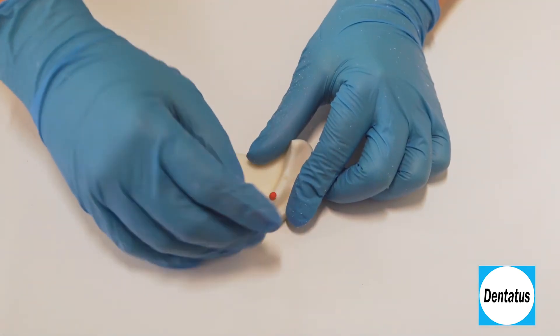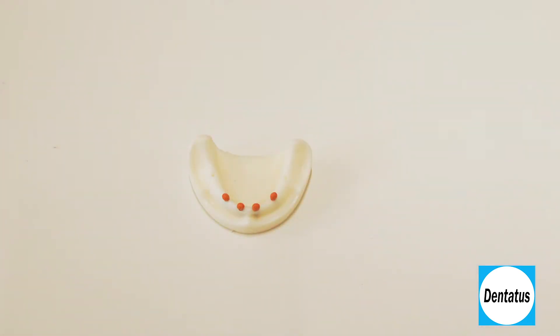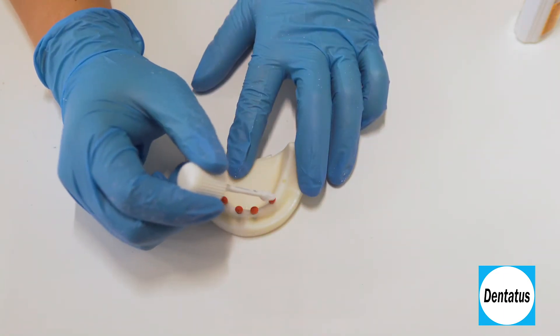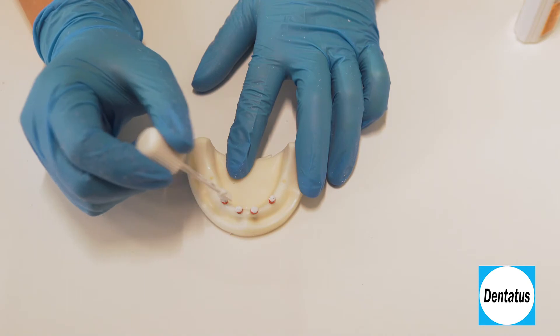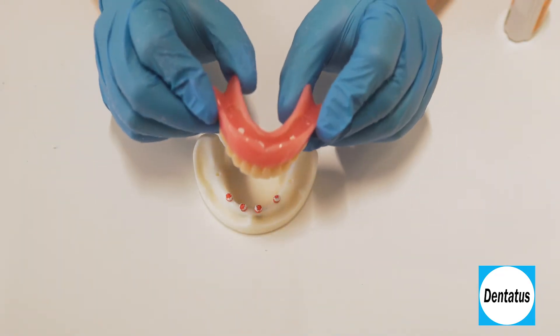In the patient's mouth, place the orange marking caps over the implant heads. Then apply a pressure indicator paste over and around the caps to transfer the markings to the denture. If you rock the denture a bit, you'll get a better record.